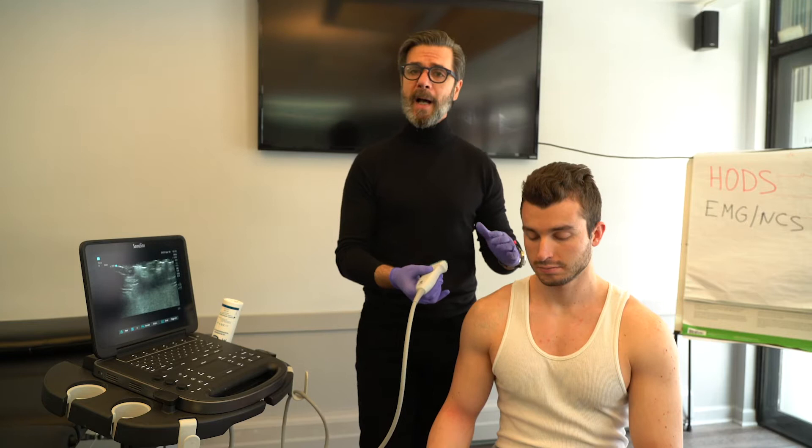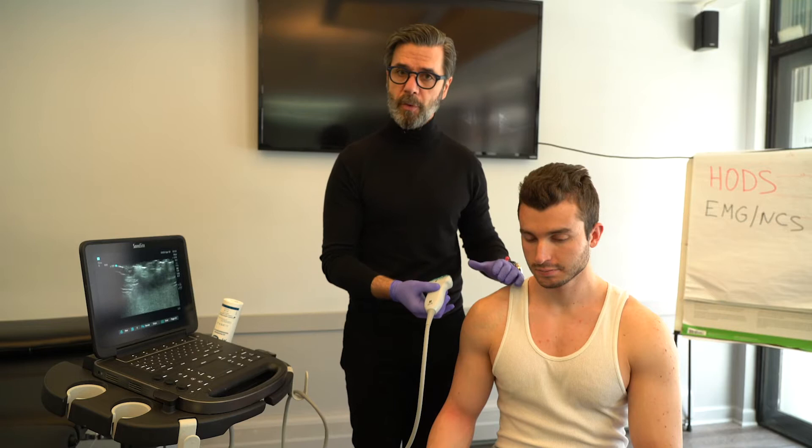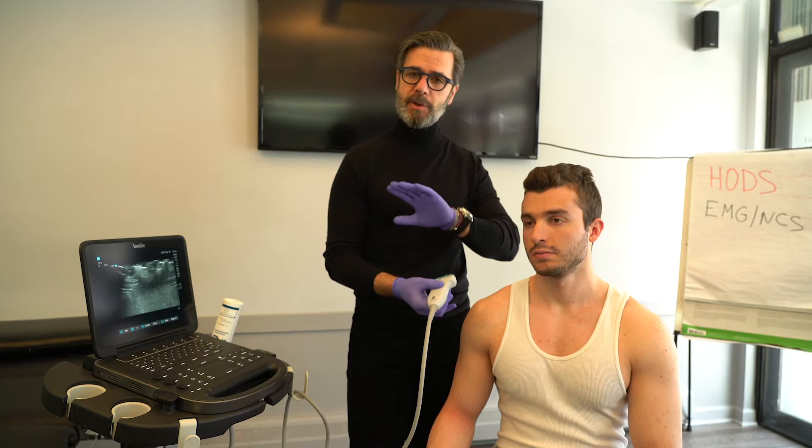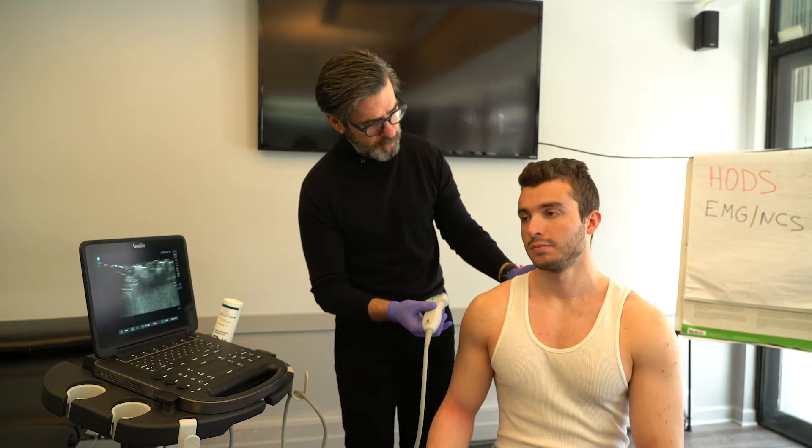When we do scanning of joints, we go through a specific protocol. For the shoulder, we always start with the bicep tendon. With ultrasound, you're going to have views in the short axis and the long axis, so you can confirm any abnormality if there is one.